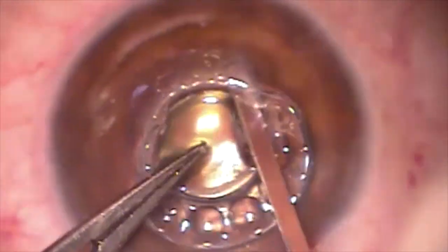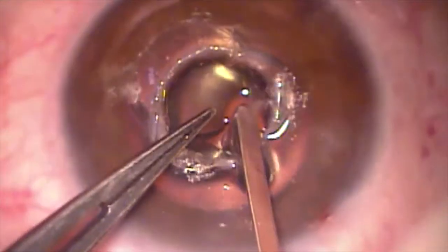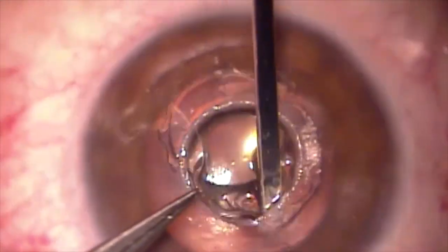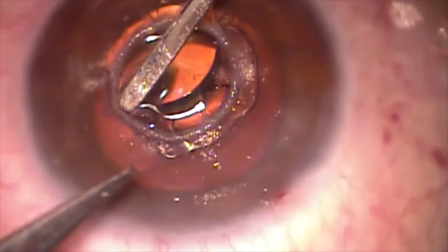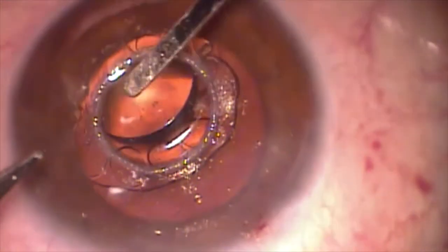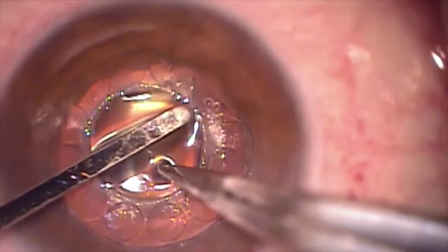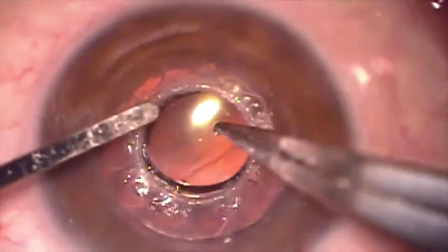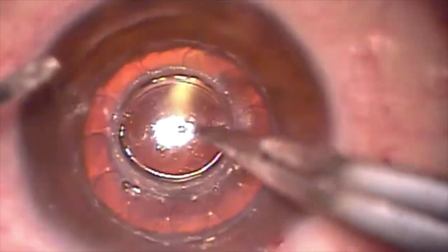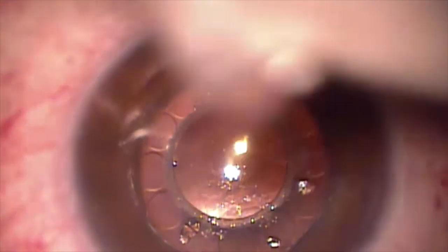Care is taken to unfurl all 360 degrees of the skirt into the pocket. A bandage contact lens is then placed over the eye.